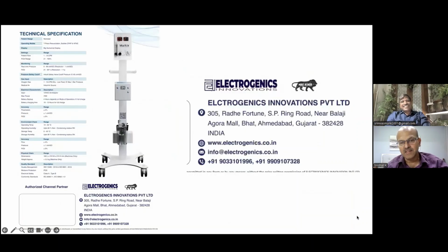So this circuit for the labor room, how much does it cost? The circuit costs about 2,000 rupees. But you need to use it only when the babies require resuscitation. So at least for the premature babies, you can start using it.